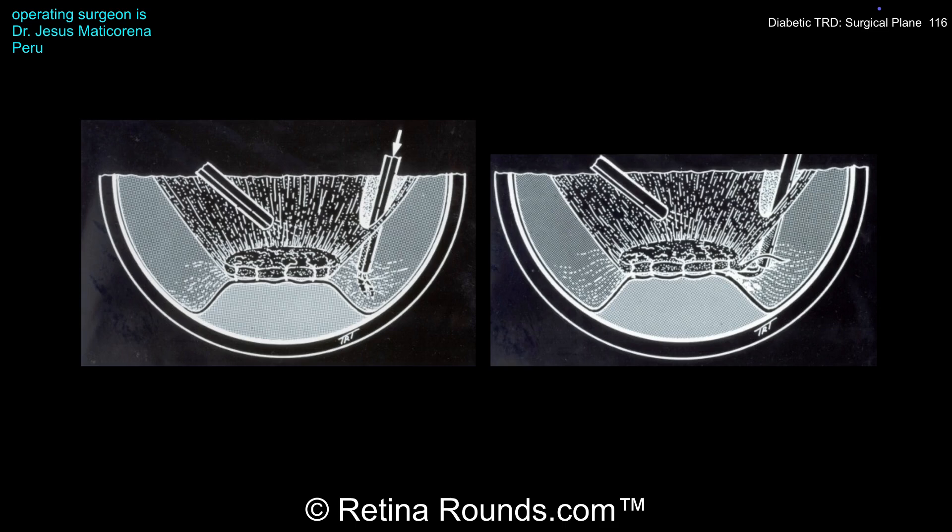Performing this segmentation of the posterior and anterior cortical vitreous may help propagate the PVD in areas where the hyaloid is still attached to the underlying retina, and can also help prevent anterior vitreoretinal traction when peeling posterior areas of pre-retinal fibrosis. Once the space is accessed, dissection can occur using the cutter, scissors, or a pick to cleave the plane and sharply dissect pre-retinal fibrosis. Working in this space will significantly decrease the chance of an iatrogenic retinal break, but slow, careful dissection is still necessary.